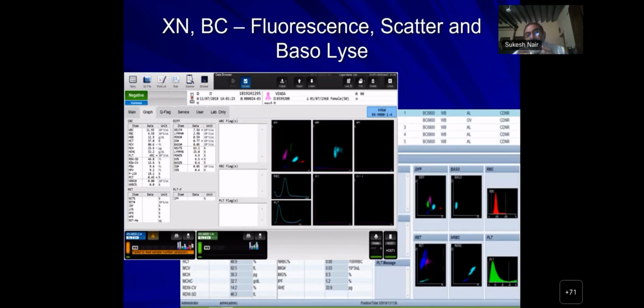Then, the nucleus of the eosinophil is bilobed and more dark than the neutrophil. That means they will not take as much fluorescence as the neutrophil. And therefore, you can see that their fluorescence levels are lower than neutrophils, but almost same as the lowest staining part of the neutrophil. But scatter-wise, they're different. So the red population shifts further.